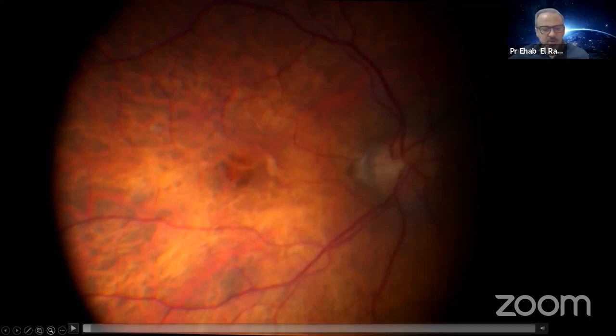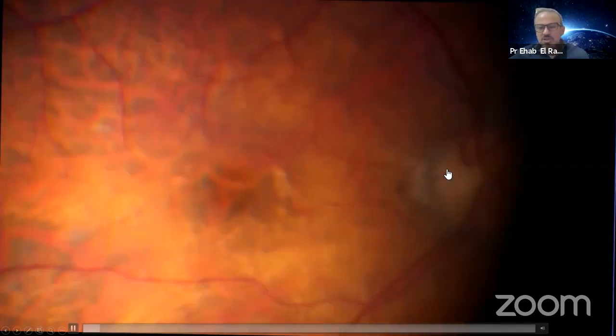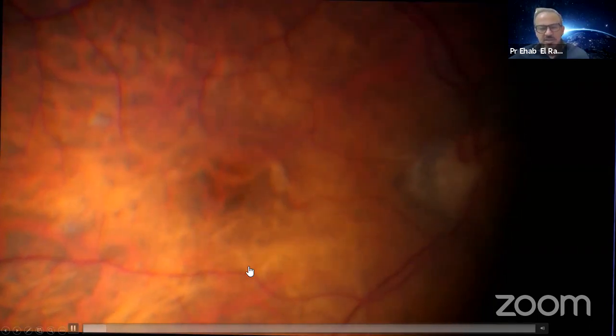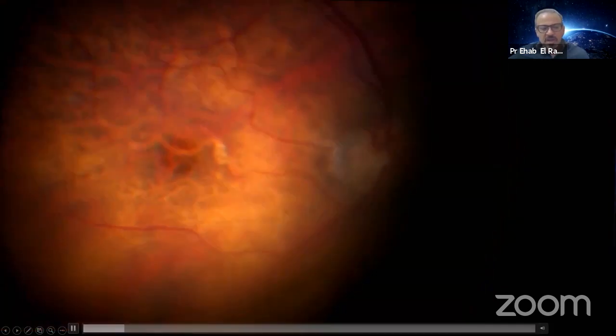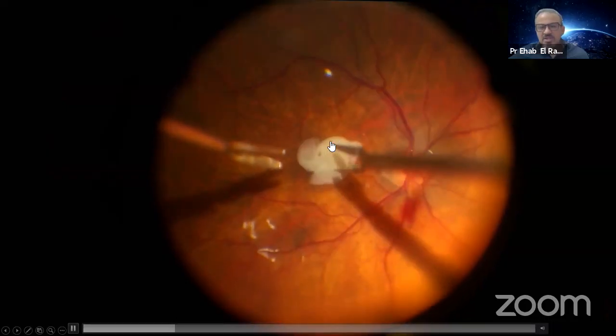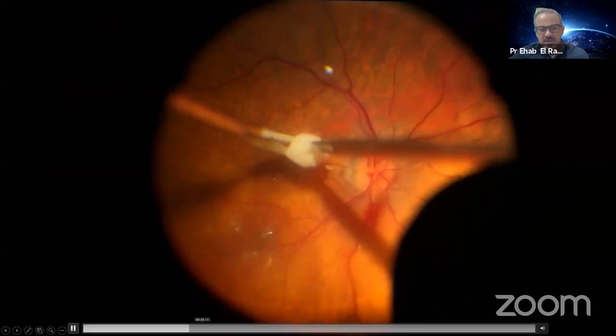This is a large macular hole right here. I decided to put an amniotic membrane. You can see the size of the hole is pretty much the size of this right here. I was going to go for an amniotic membrane. Getting a 1.5 millimeter punch from outside the eye, putting it inside, it looked very big inside. So I decided, see how large this amniotic membrane is? So I decided to trim it a little bit, make it a little bit smaller.